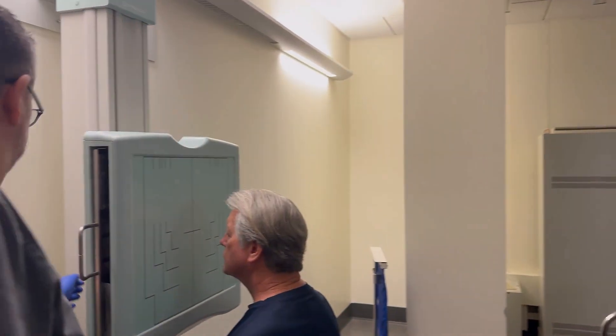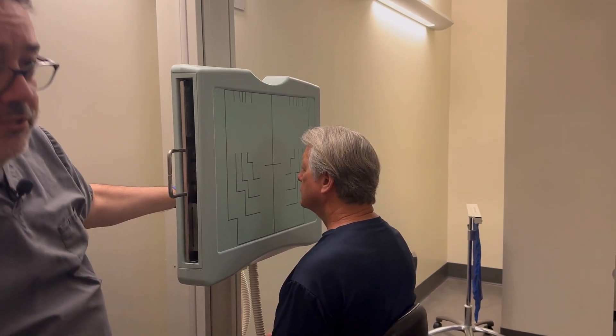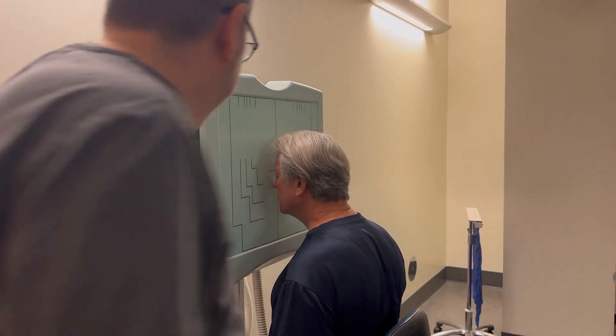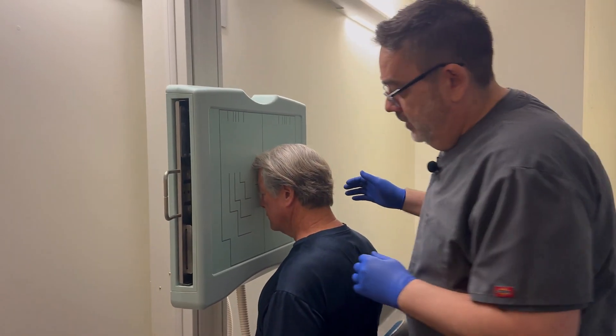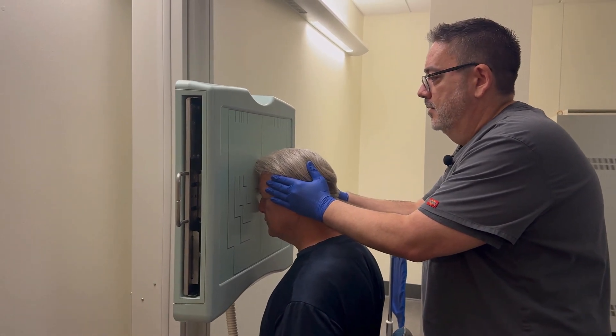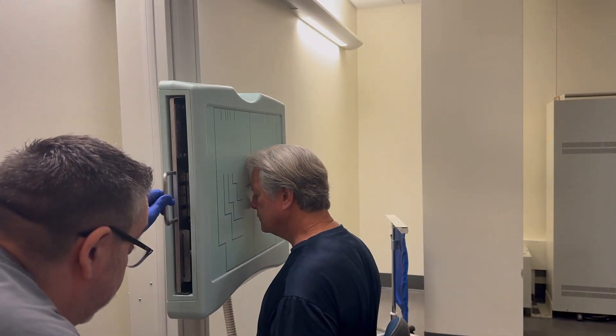I'm going to adjust the height a little bit here. Typically if you have the patient put their nose and forehead on the board, that will most often get your OML perpendicular. I'm going to move you over just a little bit, centering left to right. I'm coming over here to check OML.